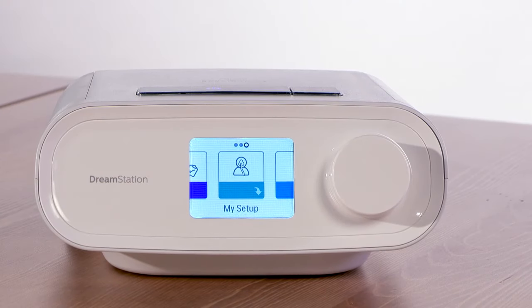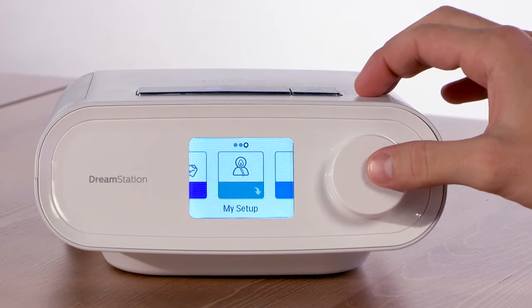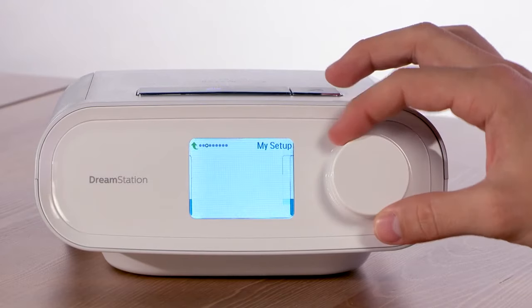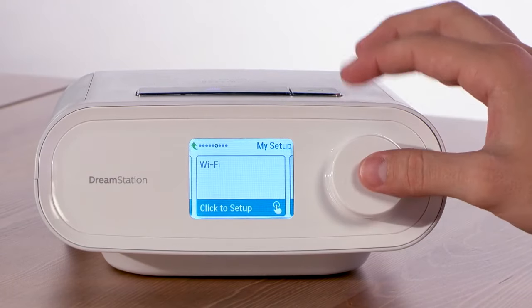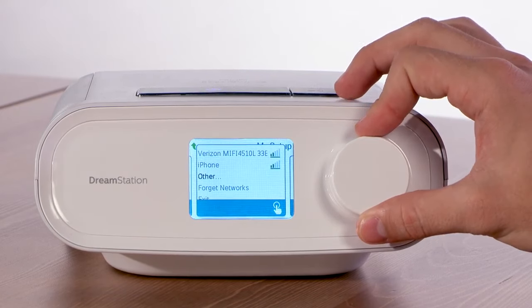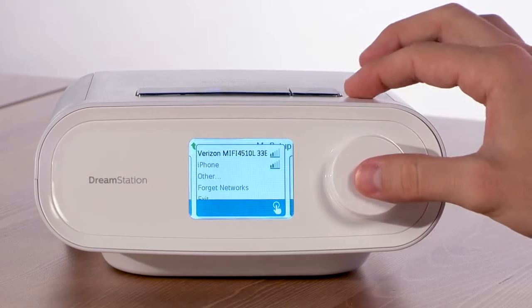Now connect your Wi-Fi accessory modem to your wireless network. First, go to the My Setup menu and press the control dial. Scroll to the Wi-Fi screen and press the control dial to display the available networks. Scroll to highlight the desired network and press the control dial to select it.